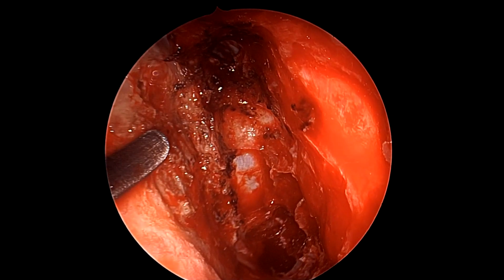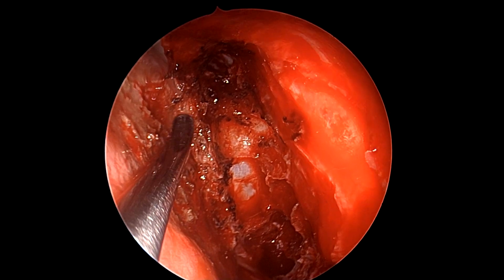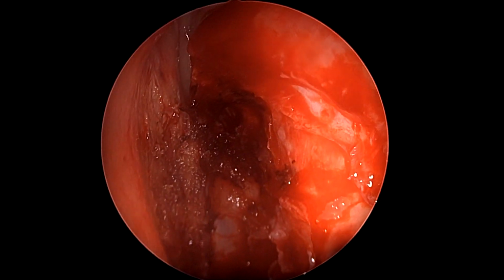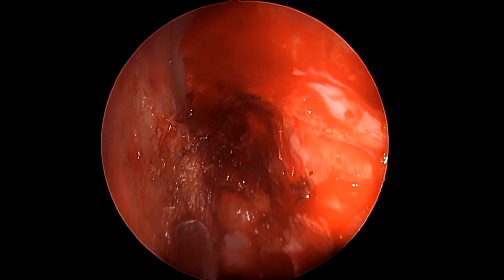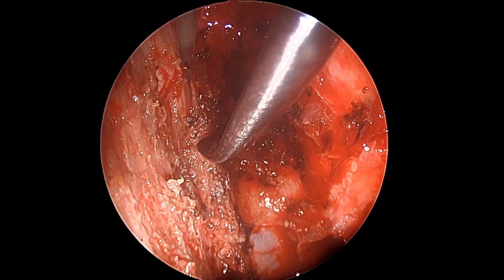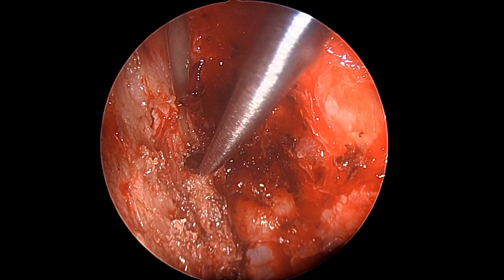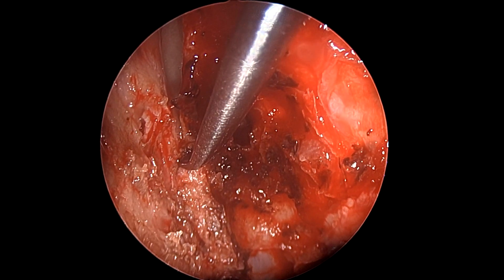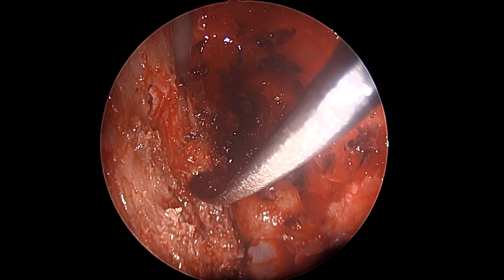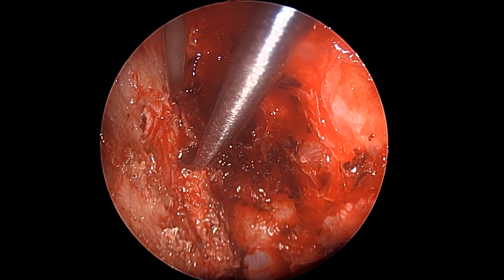Once again, we double check on the site of defect, and since it's a very small defect, options are to enlarge it sometimes to create a bigger one, but sometimes if you can find it, you can also use fat to be plugged inside it and utilize the small defect to your advantage. If, however, one has to use only fascia, then the defect has to be enlarged before you can place fat inside it. Once again, we palpate the defect using a blunt instrument to double and triple check the site of actual defect before we occlude it.